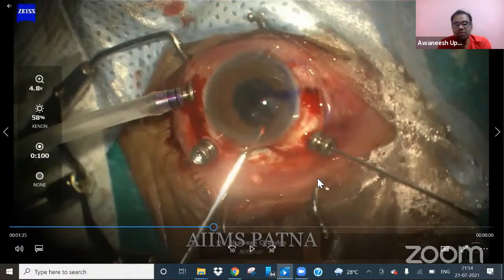There was one question from YouTube by Dr. Ayush, where he asked whether you cut an IOL within the vitreous cavity and bring it out, or do you bring it into the AC and then cut and take it out? So any takers for this? Dr. Weber, your take? When do you cut the IOL, or do you cut the IOL at all? And which ones?